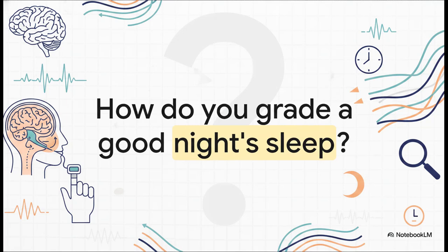How exactly do you grade a good night's sleep? Well, for most of us, it's just about how groggy we feel when the alarm goes off, right? But in the world of sleep medicine, waking up refreshed is really just the tip of the iceberg. Behind the scenes, sleep technologists act almost like medical detectives. They're combing through pages of physiological data to figure out exactly what happens to our bodies the second our eyes close. So let's dive into the exact criteria they use.